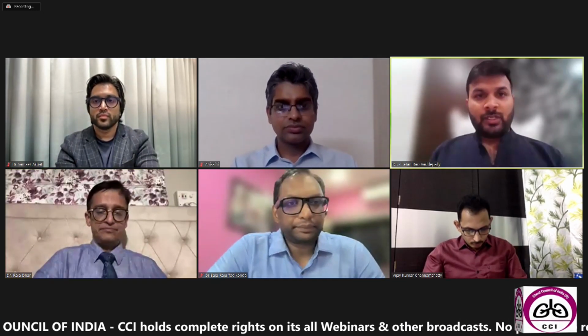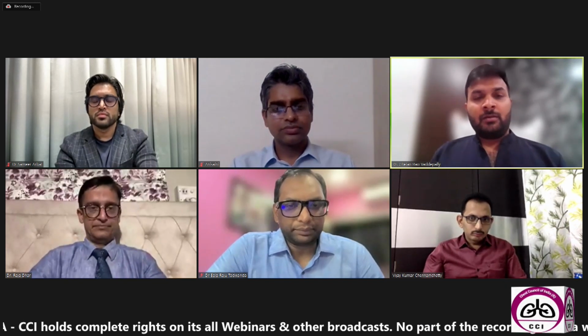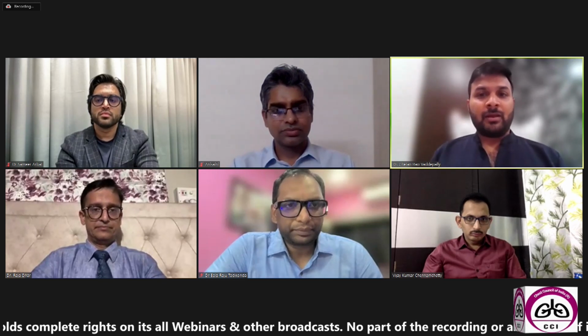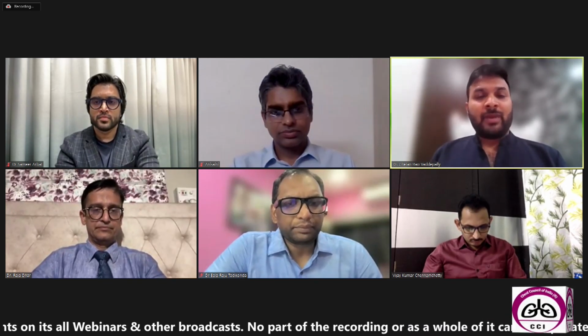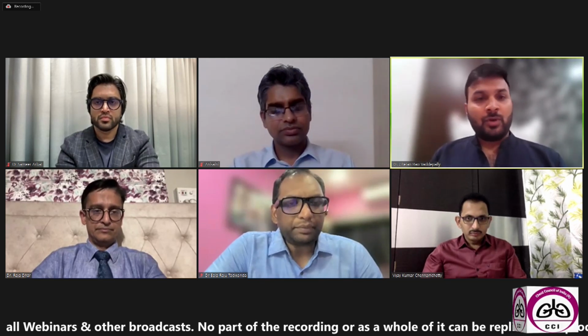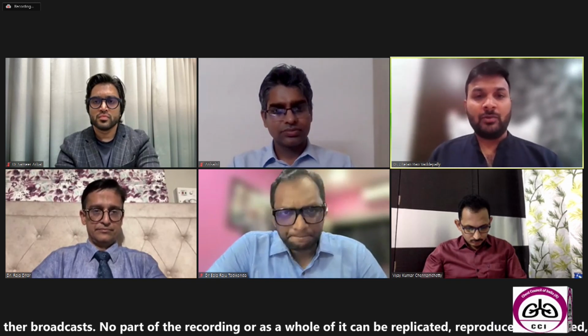Yes, sir. So initially, the options that we had were nitrous oxide and carbon dioxide. But right now, as Dr. Balraju said some time back, the RB cryo 2 is compatible only with carbon dioxide, and we don't have any other option. It is just carbon dioxide. And that's the reason it's exclusively used for pulmonology.